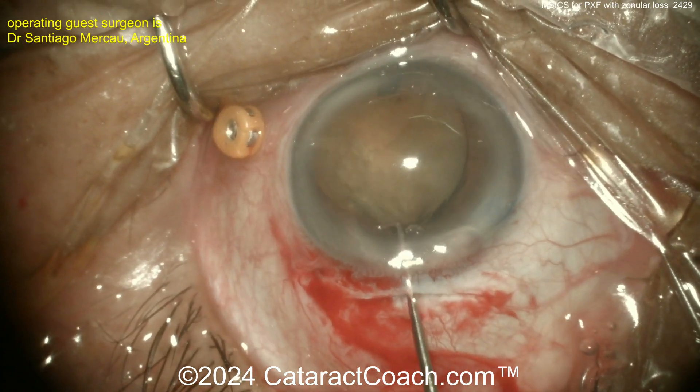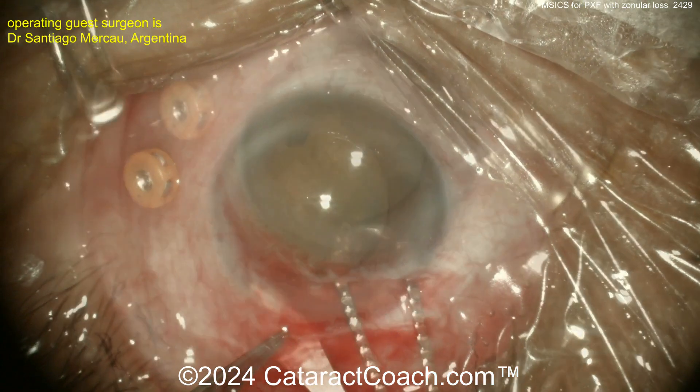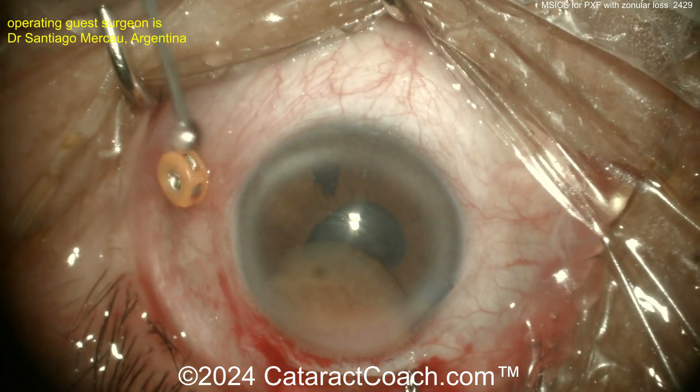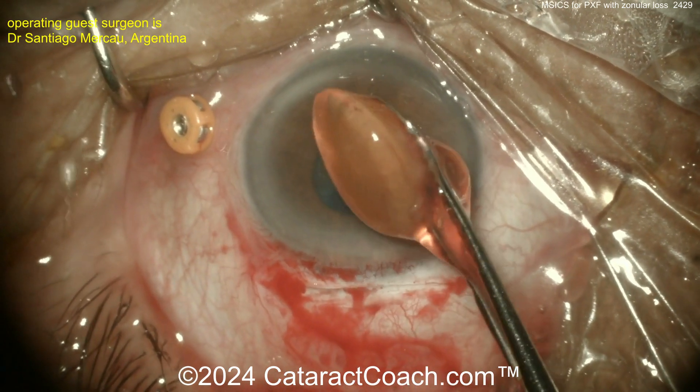I promise it's not that hard. Now once the nucleus is up in the anterior chamber, enlarging the incision — notice how it's funnel-shaped or trapezoidal, wider on the inside than the outside. Plenty of viscoelastic to protect the corneal endothelium. Slowly extracting the nucleus — there it is. You don't want to scrape the endothelium. The nucleus is delivered very nicely.